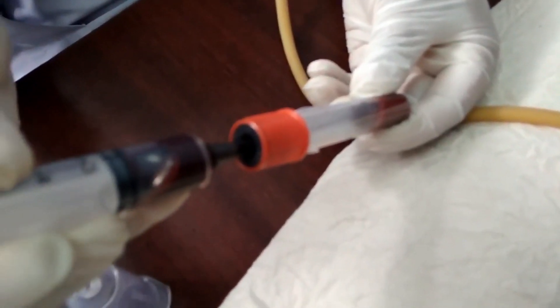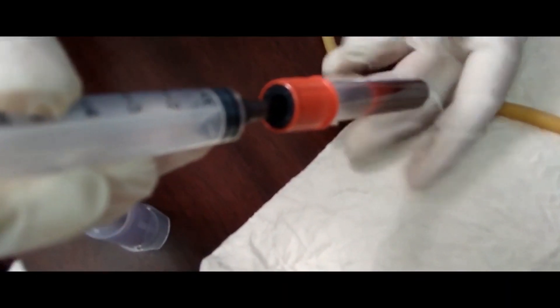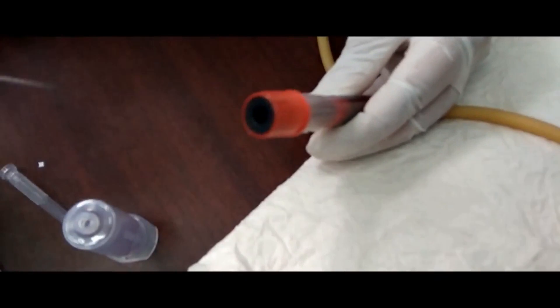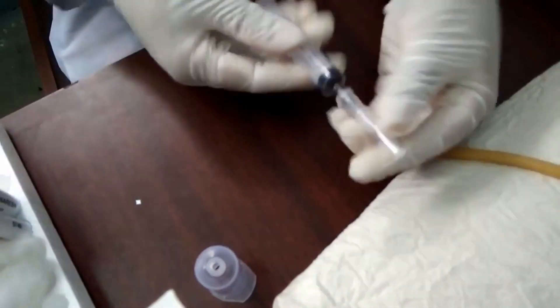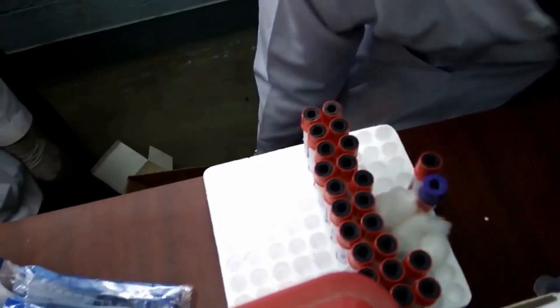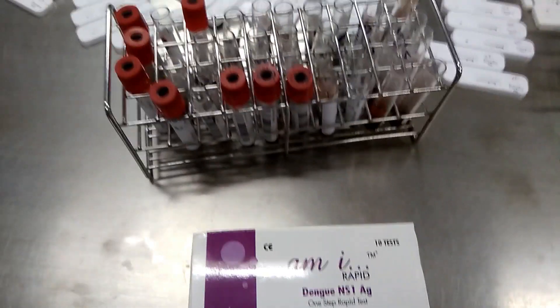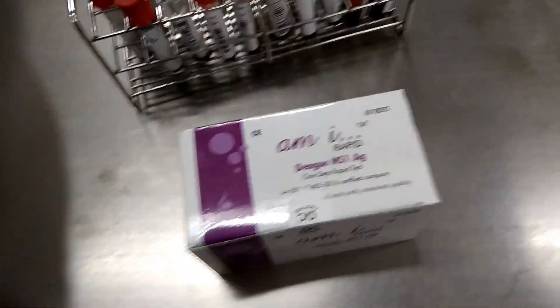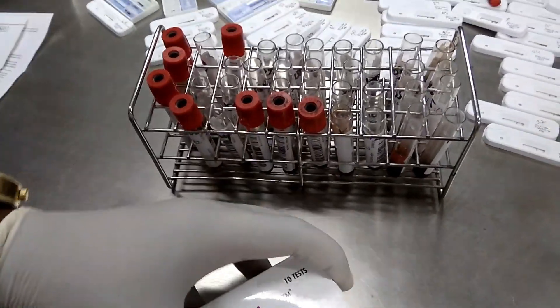Now, about NS1 antigen detection. First, collect the specimen — that is blood — from the patient in a plain vial, that is a vial without anticoagulant. Then leave it for 10 minutes for clotting. After that, centrifuge. After centrifugation, you will get serum.